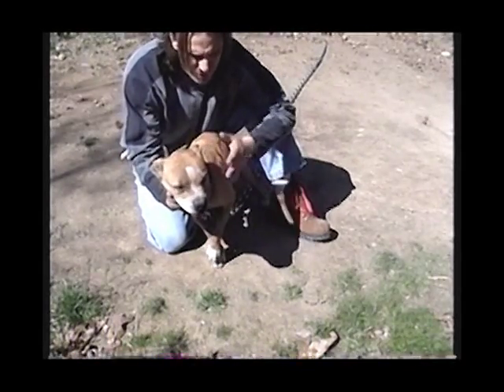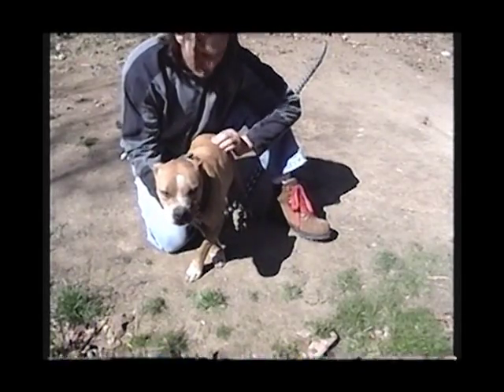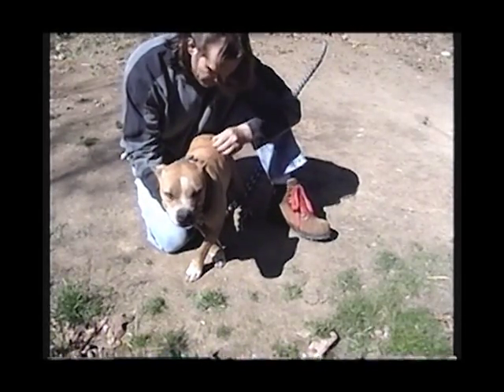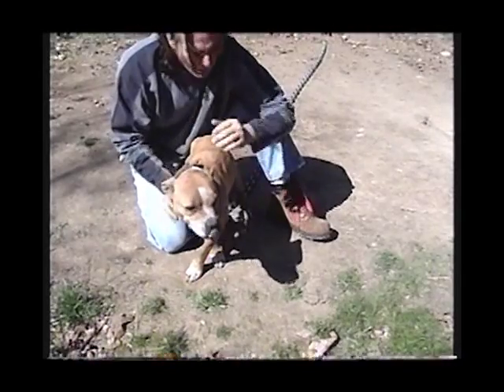It helps if you have a docile bitch. If a person spends any time and trains a dog, they have manageable animals that they can handle easily without any problems. I'm going to go ahead and get into the technique of showing you how you can do this yourself with your bitch and draw your own blood.